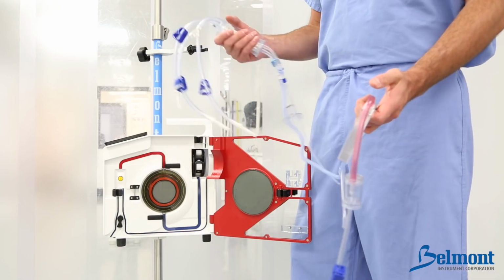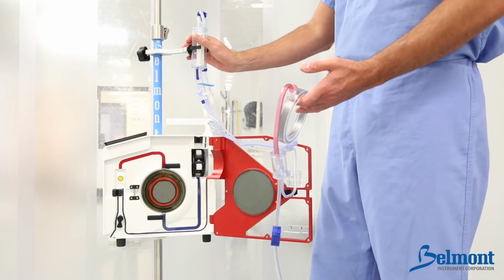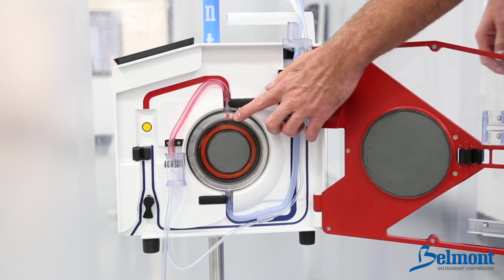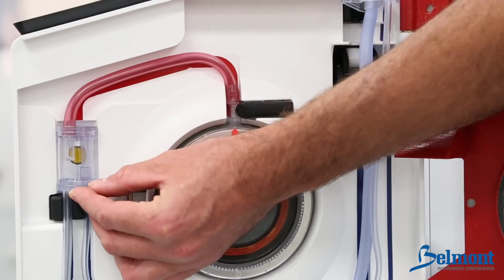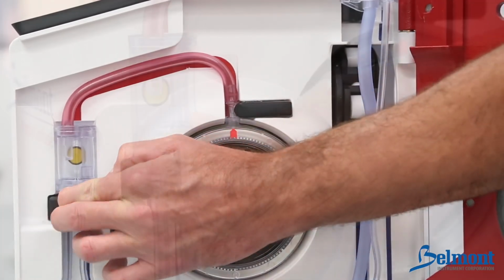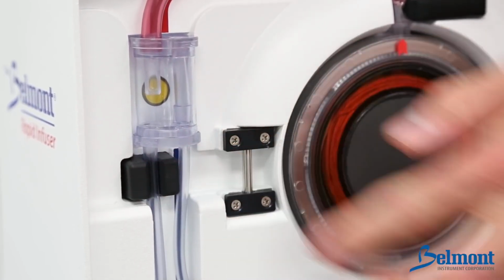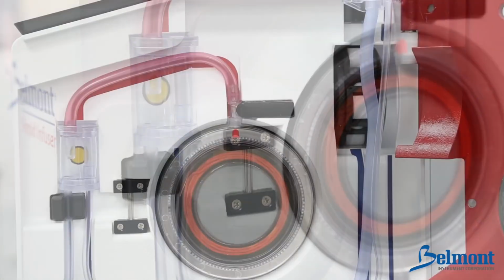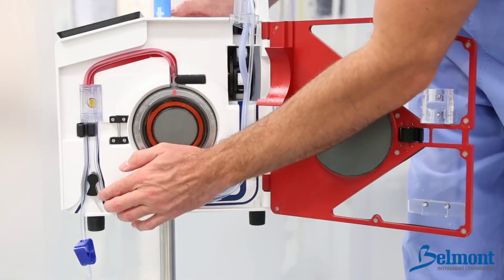Holding the heat exchanger in your left hand and reservoir chamber in your right, snap the reservoir chamber into the holder. Insert the heat exchanger with the red arrow pointing up. Align the red tubing on top of the red stripe and place the pressure chamber into the pressure channel. Press the infuse line into the secondary air detector to the left of the patient safety valve wand. Note, the infuse line should be at or below flush within the air detector. Place the thinner recirculation line to the right of the air detector and to the right of the valve wand.